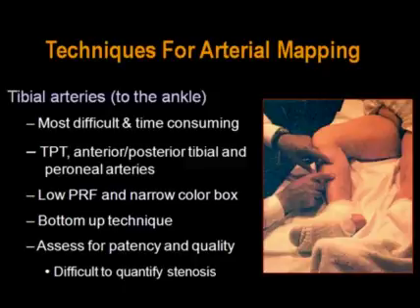Keep in mind that if the patient is a candidate for a distal bypass graft, you would not want to bypass above the level of an occlusion, and so imaging from the top down only to run into an occlusion might result in a lot of wasted time. So again, we start from the bottom and work our way up in these vessels, although we do image the entirety of those vessels. We assess those vessels for patency as well as for quality in terms of a target for a distal anastomosis site.